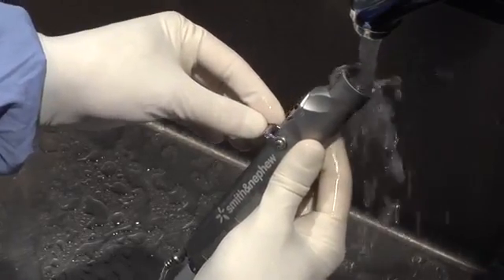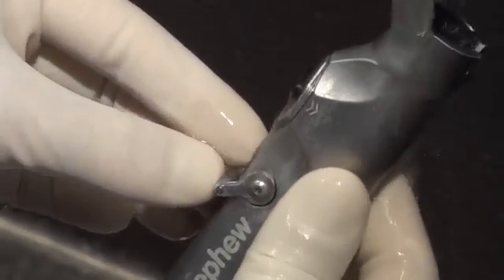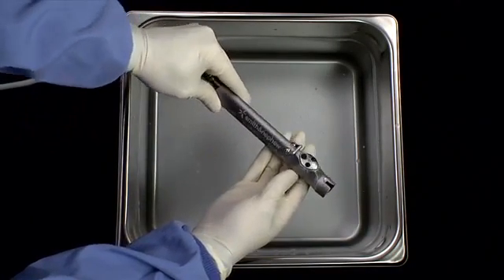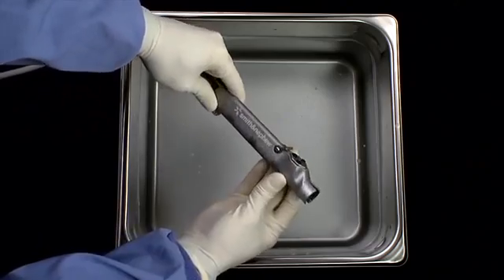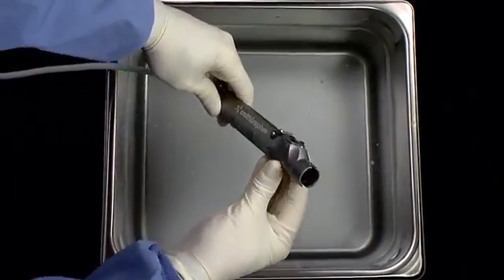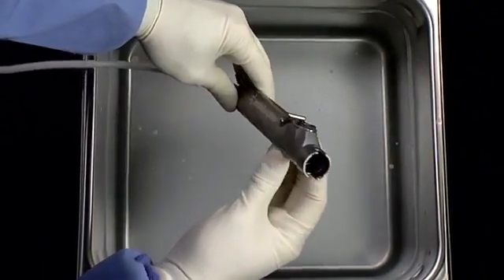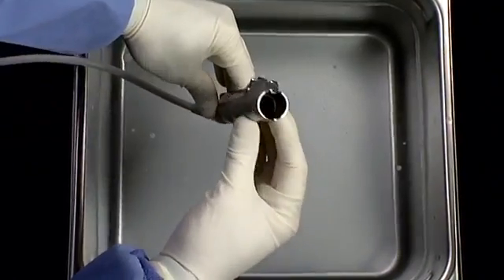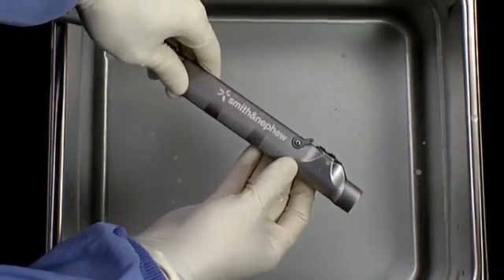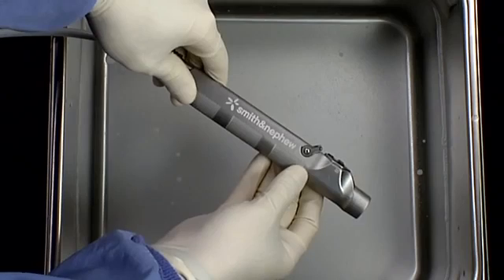Ensure that the suction control lever is opened and closed repeatedly while rinsing the device lumen. After cleaning, inspect devices under normal lighting to ensure that all visible soil has been removed. If not visibly clean, repeat cleaning and re-inspect. For difficult-to-view areas, 3% hydrogen peroxide may be applied — bubbling is evidence of the presence of blood. Please note: rinse instruments thoroughly with warm tap water following any hydrogen peroxide testing.